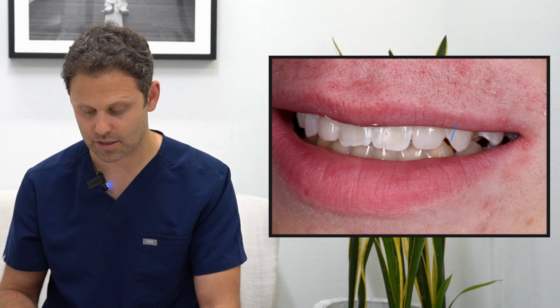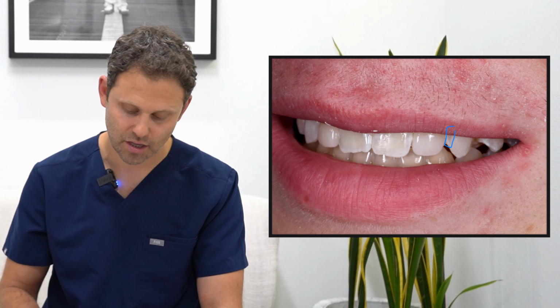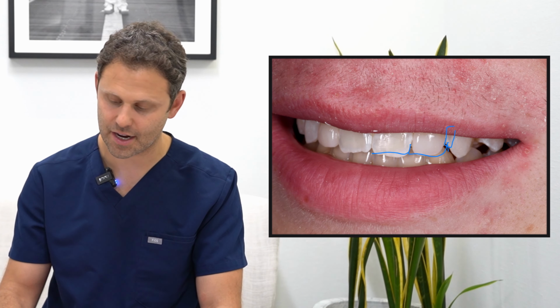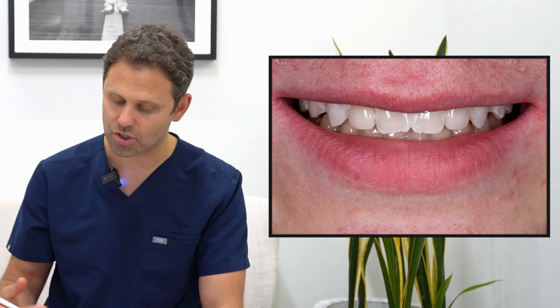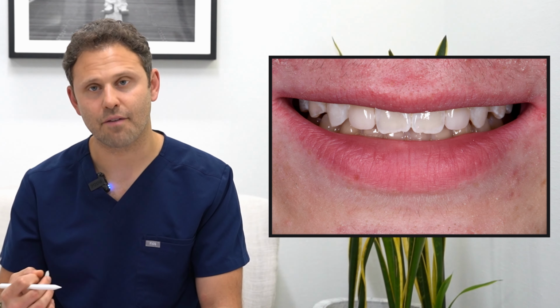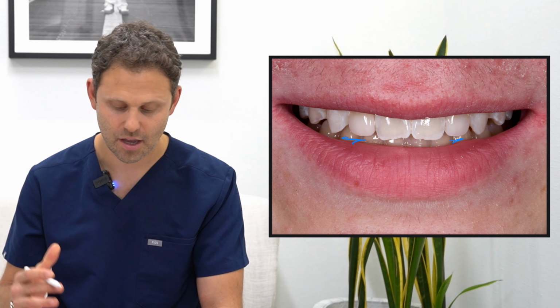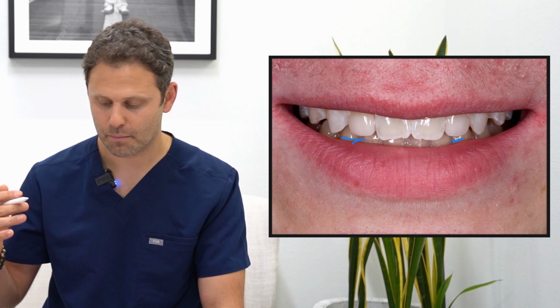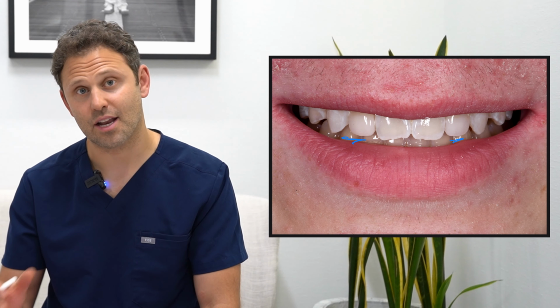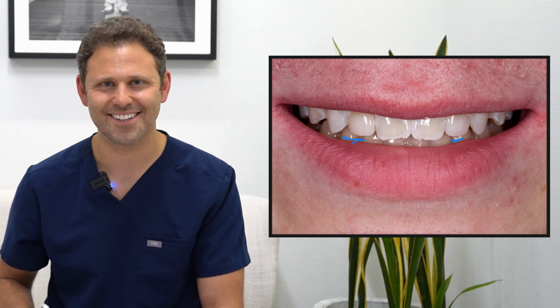You can see there's no black looking through, no gray aspect of the tooth. The shapes of them are identical to what a natural tooth should look like. And here you have a smile with someone that feels confident, doesn't have teeth that are sticking out further than they should be, and colors and a smile that blends in with him, so that he can now forget about this whole journey that he's been through and move on to tackle the next part of his life.